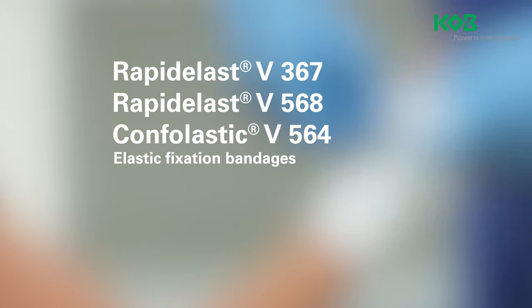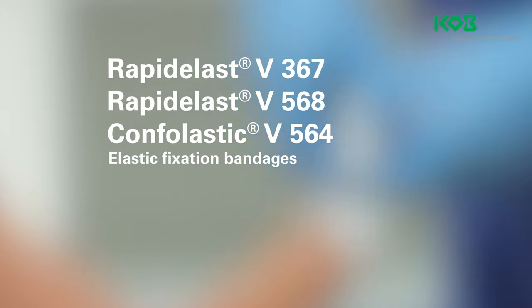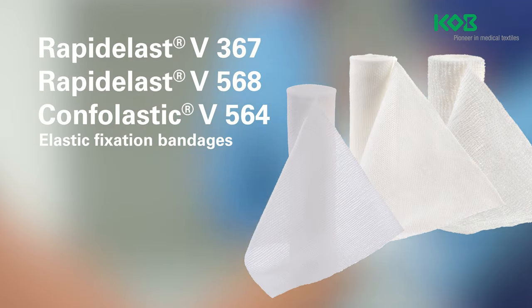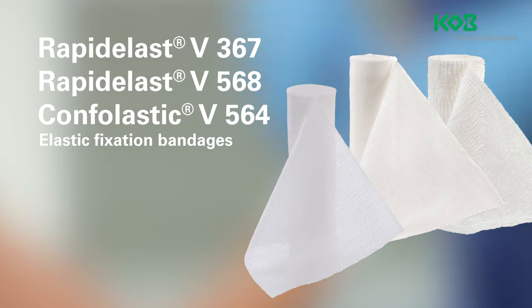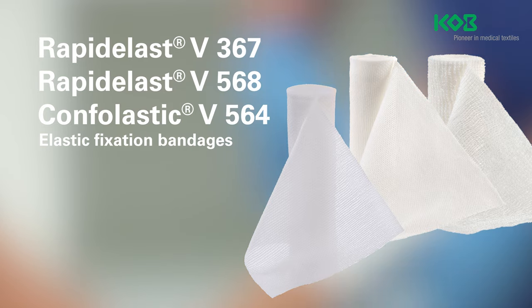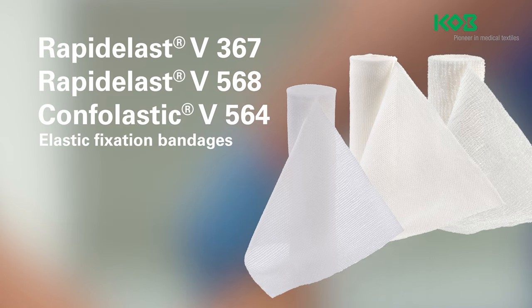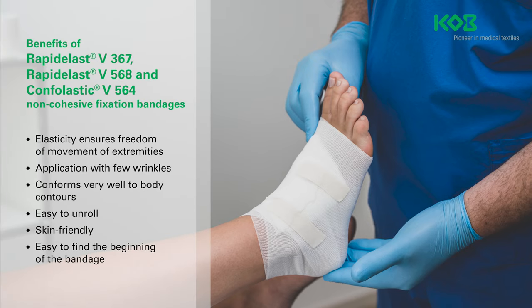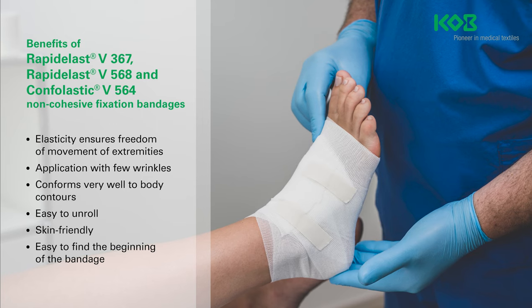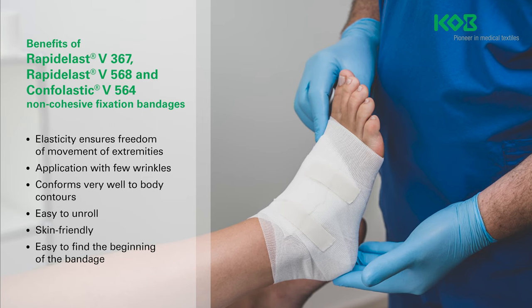Elastic, non-cohesive fixation bandages such as Rapidilast V367, Rapidilast V568 and Confolastic V564 are increasingly used for the fixation of primary and secondary wound dressings, catheters and cannulas, and in particular for fixation to joints and tapered and rounded parts of the body. These fixation bandages can be applied by laypersons and healthcare professionals in both clinical and home environments.